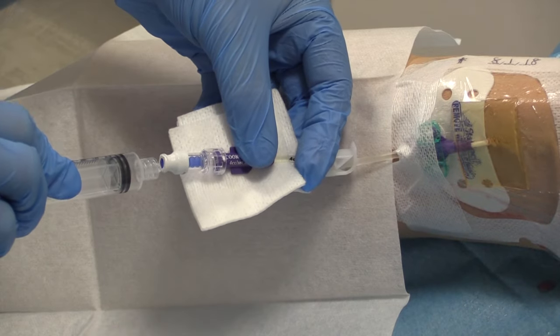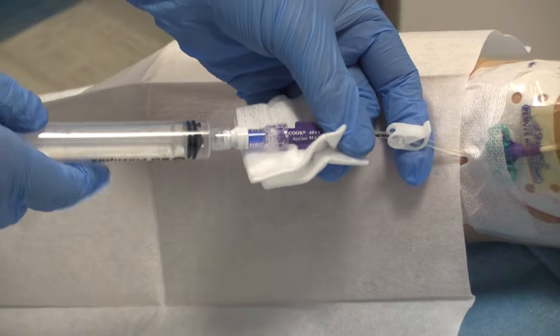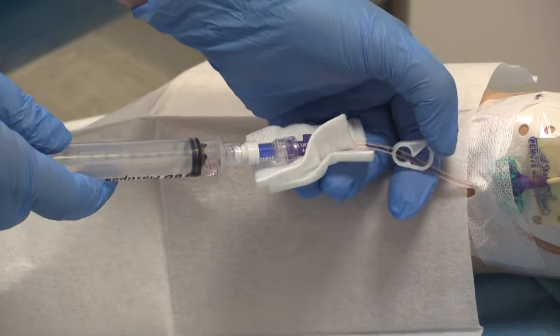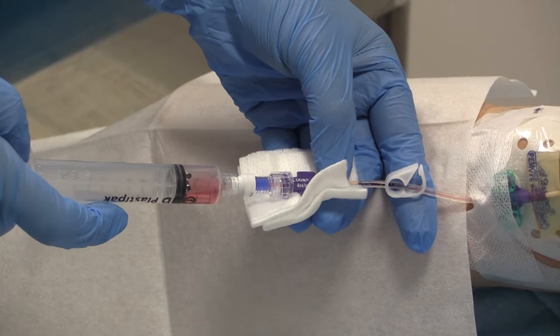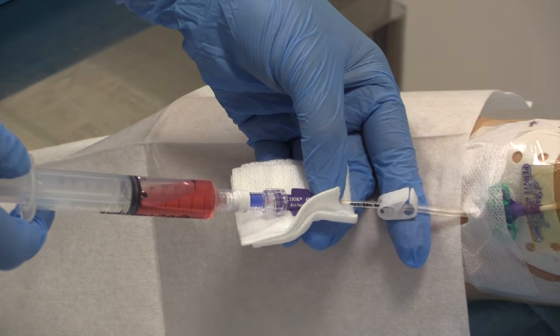Attach an empty 10ml Luer lock syringe. Apply suction to the line whilst unclamping and withdraw 5 to 10 mils of blood, which can be discarded, or if required for line sepsis, used for blood cultures. The line should be re-clamped as you withdraw the last 1 to 2 mils.